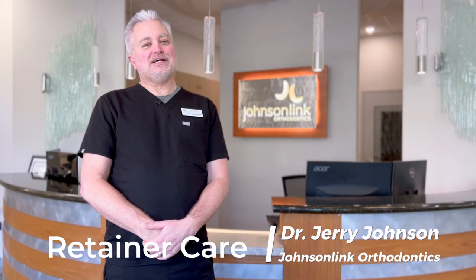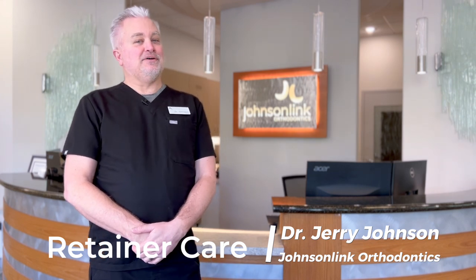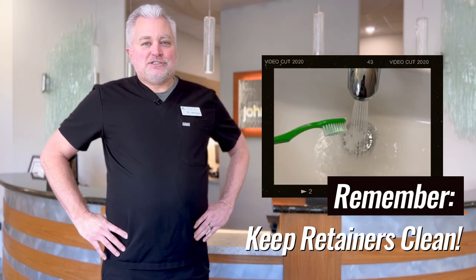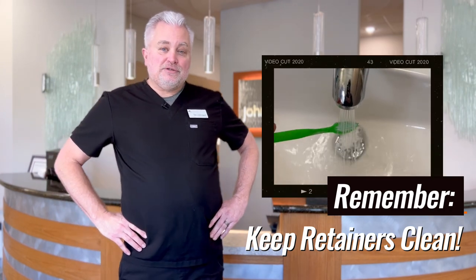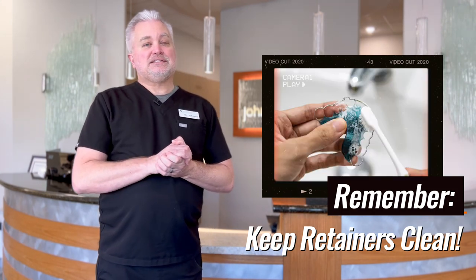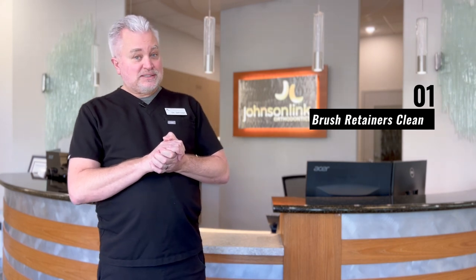Hi, I'm Dr. Jerry Johnson from Johnson Link Orthodontics and I'm here to talk about how to take care of your retainers. The first thing to remember is that you need to keep your retainers clean. Every time you brush your teeth when you're wearing your retainer, you should take out your retainer and brush your retainers at the same time. That's the number one primary way of keeping your retainers clean — simply brushing them.